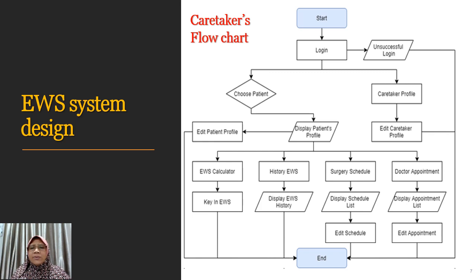Once the user displays the patient's profile, they can start recording the vital signs, and also do the EWS calculator, view the history of the EWS, and also insert surgery schedules or doctor's appointments. So all of these can be viewed and stored and saved, and the data is tabulated and saved in a server in the cloud.